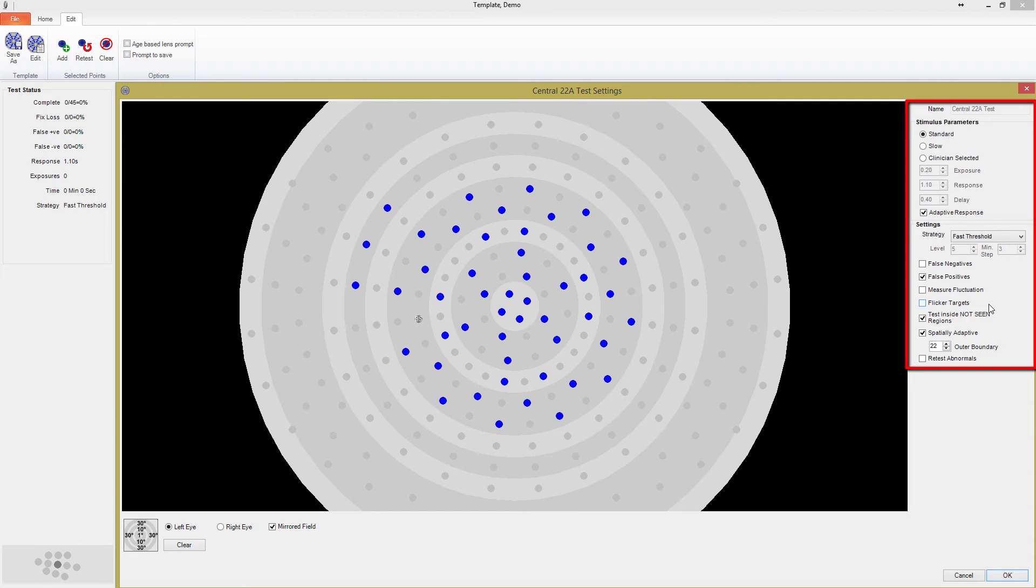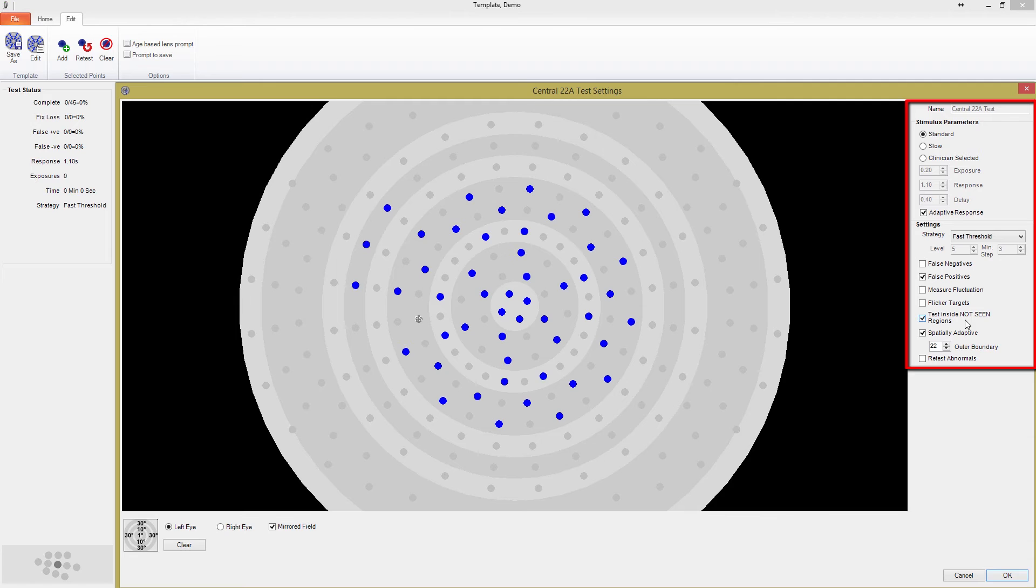Moving on, you'll see the Test Inside Not Seen Regions option. It works by thresholding around large defects without testing inside of them. When the software finds a continuous, not seen perimeter of a defect, it classifies the entire area as a not seen region. With this button unticked, not seen regions will automatically have all their internal points set as not seen. This is helpful in reducing the test time for patients that are known to have large defects and is turned off by default during the neurological test.